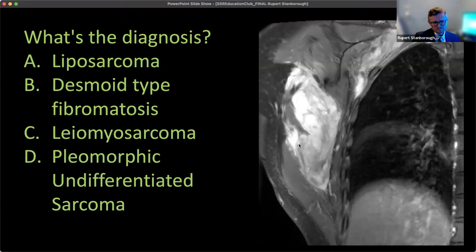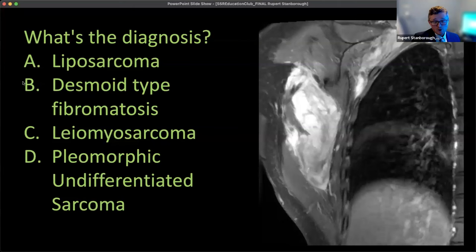What do you think the diagnosis is? Is it a liposarcoma, a desmoid type fibromatosis, a leiomyosarcoma, or a pleomorphic undifferentiated sarcoma? Remember the patient's age — 20 years old — and the signal changes in parts of the mass.